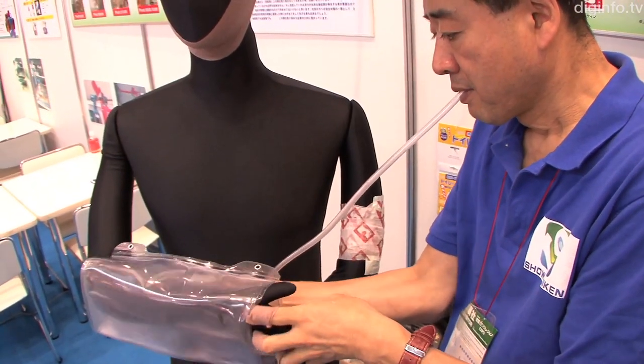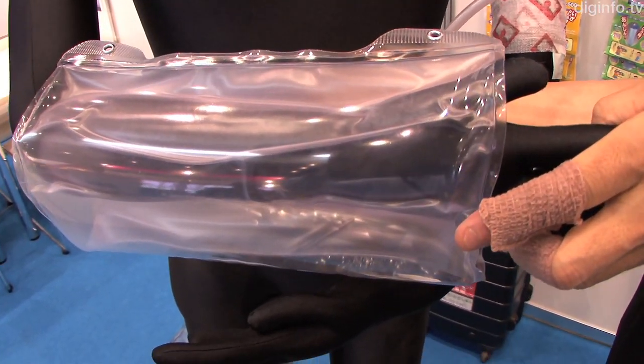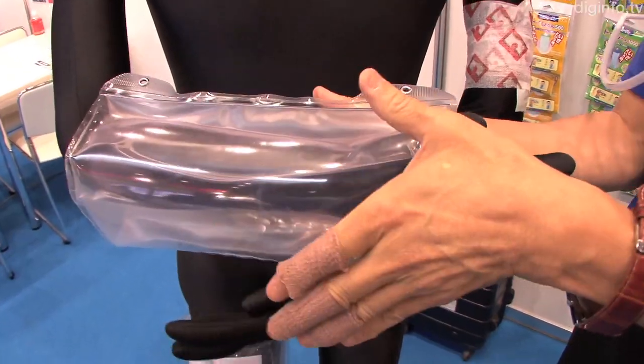The Multi-Protector is available online under the product name Air Gibbs Suiha. The arm version is priced at $47 and the leg version at $65.